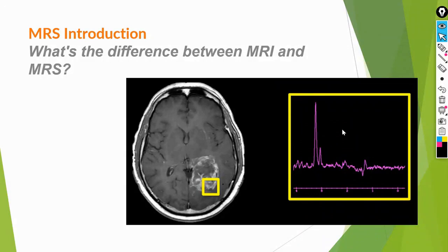So how do I do that? You said you want to take my information not just about the tumor but your internal condition, which is very important. So how do I do that? I want to obtain my signal from the metabolites, not just from water. The most significant signal I have is from water.